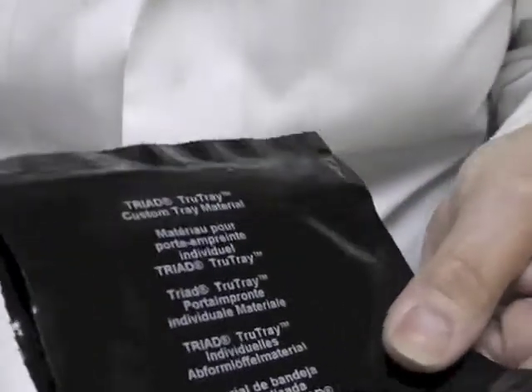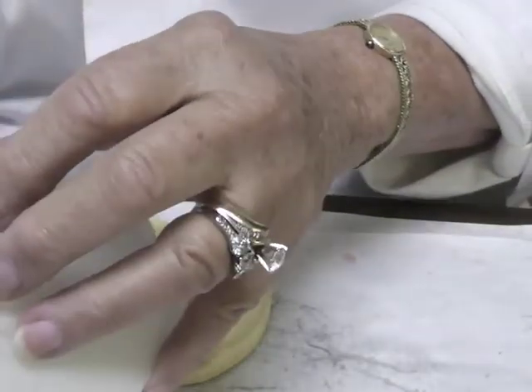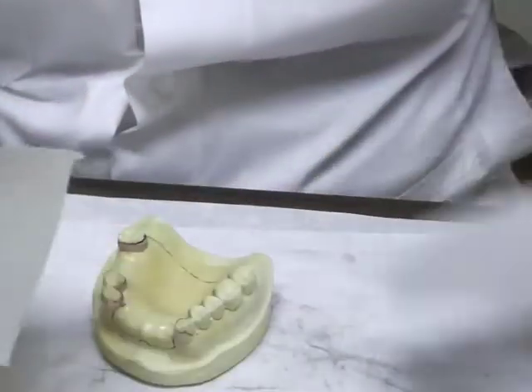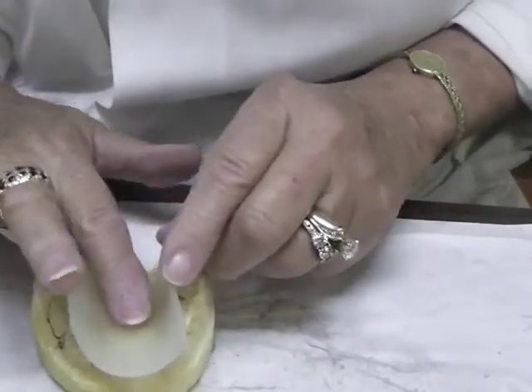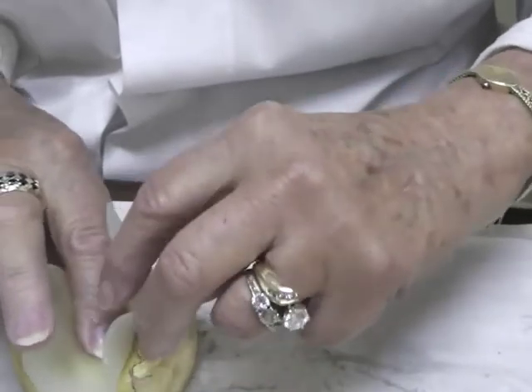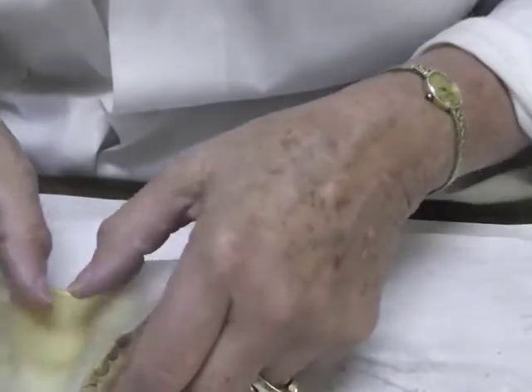Open the triad package when you're ready to actually use it. Take it out and place it on the cast. Now the thing I'm seeing you all do is that you're pushing too hard and you're thinning it — you want the final result to be about that thick. So put it on the cast, adapt it. I would start at the middle because you'll catch an air bubble right there in the deep palate. Start at the middle, work your way backwards, and press it up against your teeth.